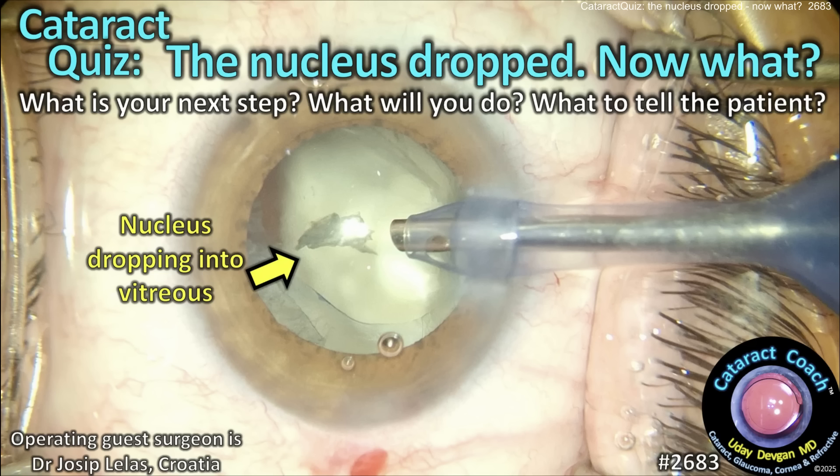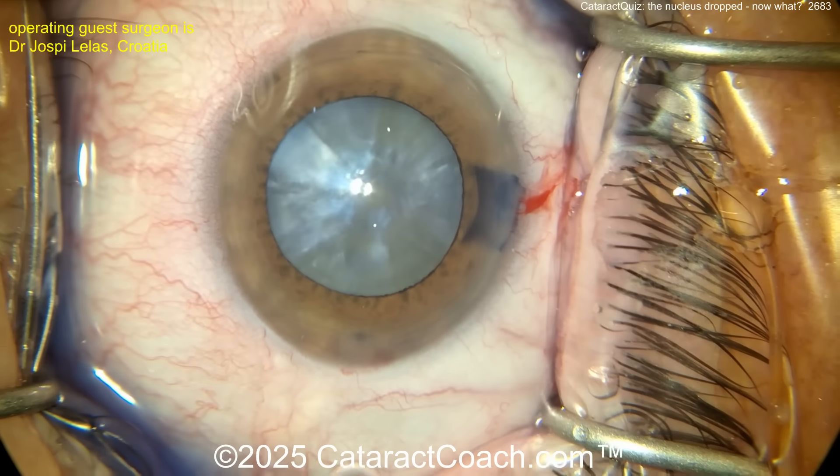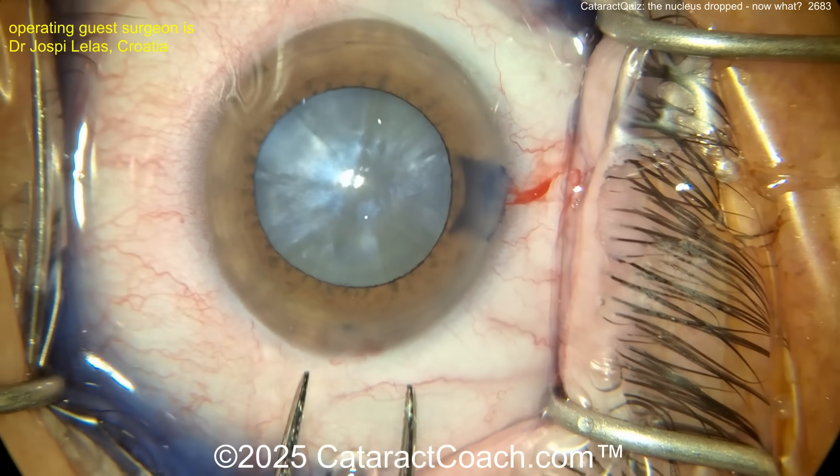Cataractcoach.com cataract quiz: the nucleus just dropped. Now what are you going to do? What's your next step? How are you going to solve this case? What are you going to do to tell the patient? Let's watch this case.